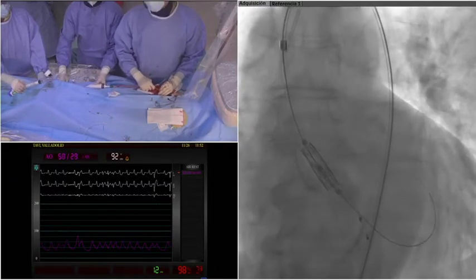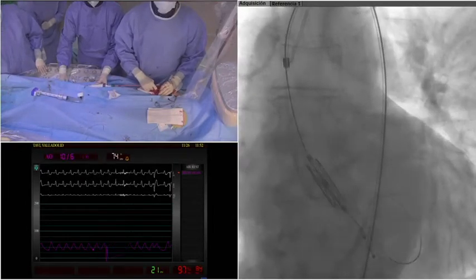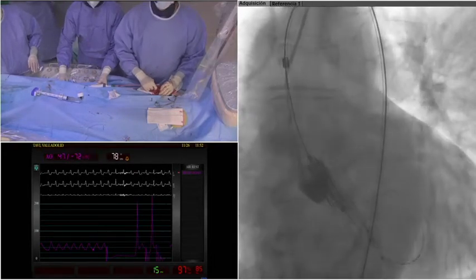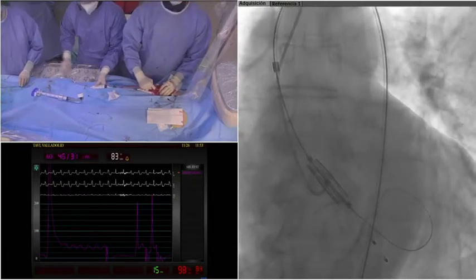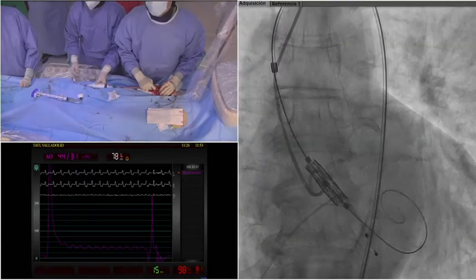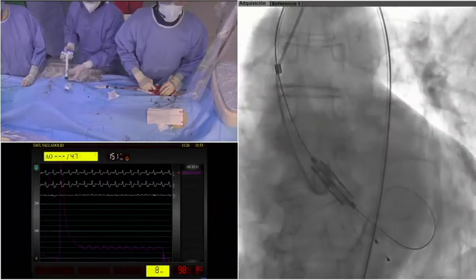I'm advancing now. Test. Test. Okay, we are maybe a little bit high, so I'm going to push a little bit more. Okay, there we are. Can you see the darker band? Cine? Yes. Okay. We are going to go quickly because the patient is hypotensive.